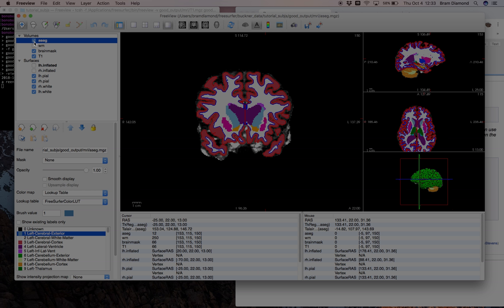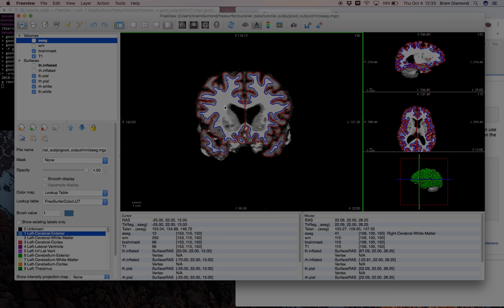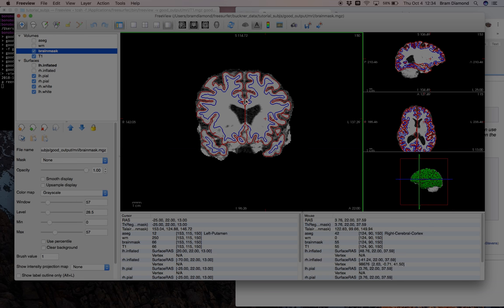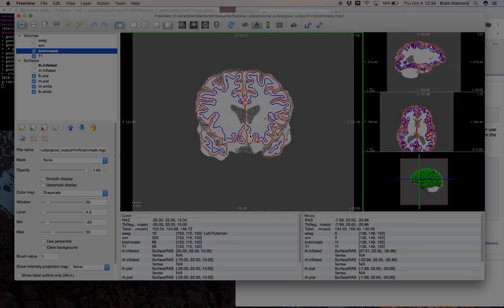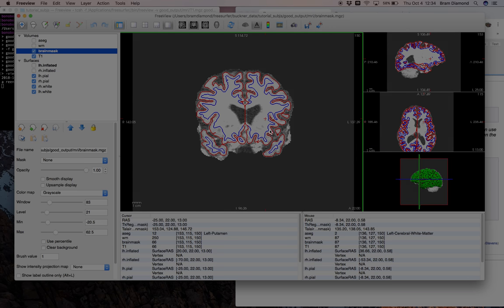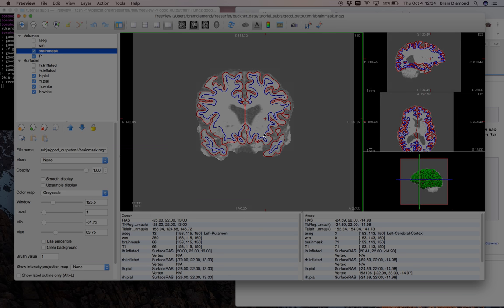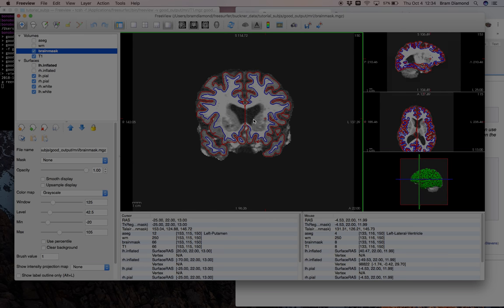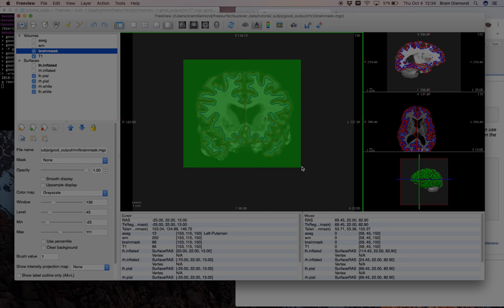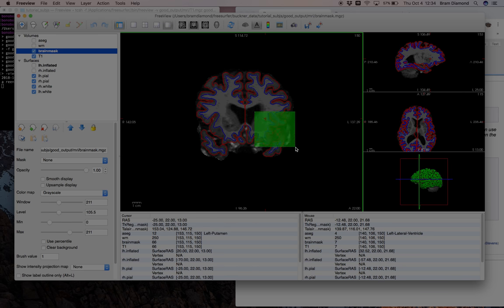FreeView automatically interpolates voxel data to display the image in a way best for the human eye — this is called thresholding or windowing. Sometimes a large intensity bias or other nuance in your data can mess with the thresholding, making it hard to see what's going on. You can manually window by holding Shift and dragging — left and right changes saturation, and up and down changes brightness. You can also use auto windowing by holding Shift and the middle wheel and dragging over the brain region you want to optimize.